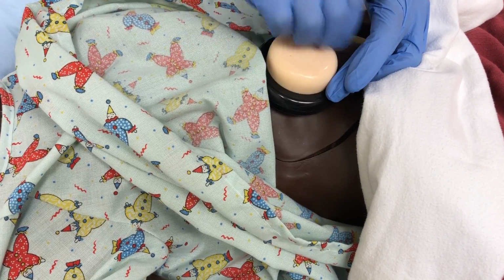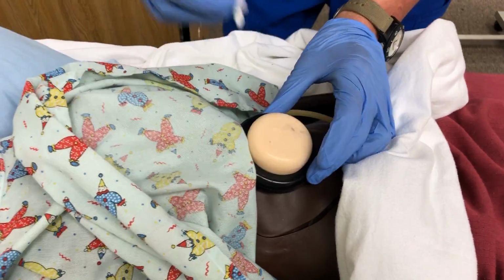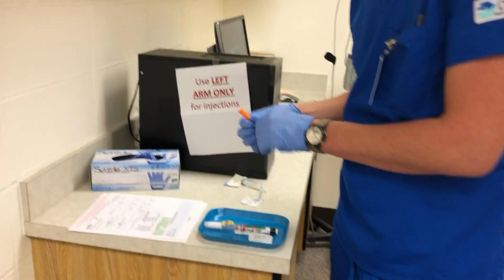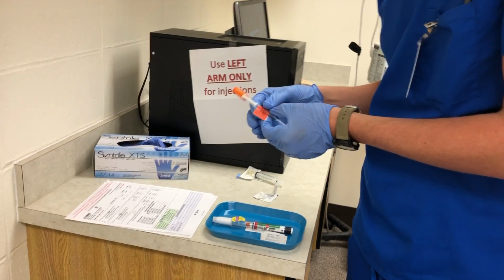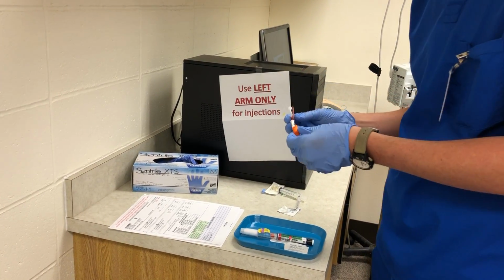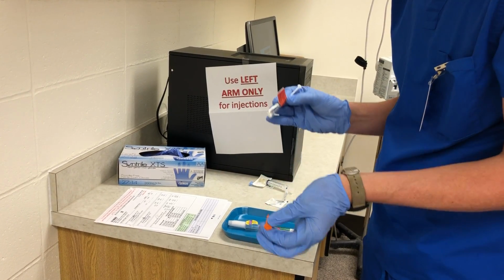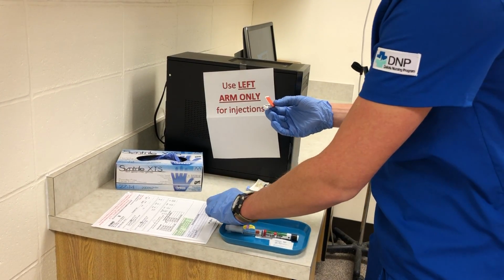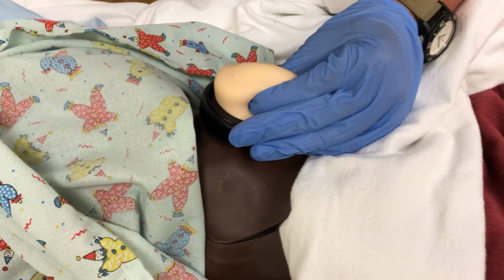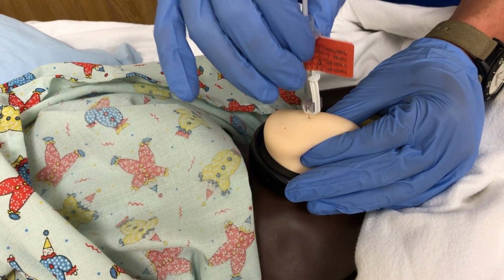Starting in the middle and then going out in a circular motion. Okay. And then I'm gonna grab my first medication, which is that mix of the NPH and R, and then we're just gonna pop that off. And we're gonna pinch, and this is gonna be on this side, and then we're just gonna go straight in. Ready, Shirley? 1, 2, 3.